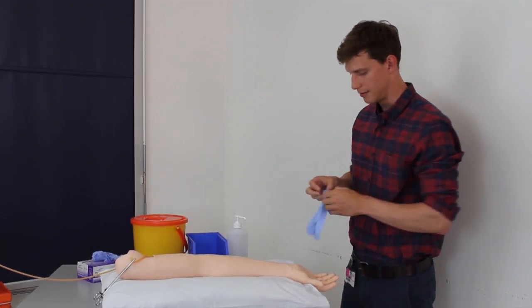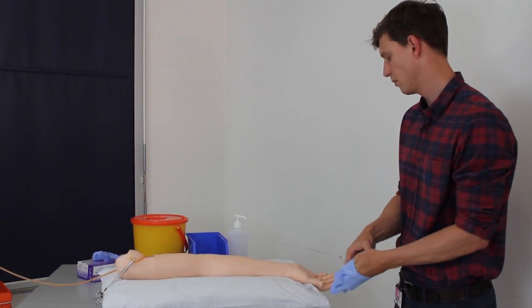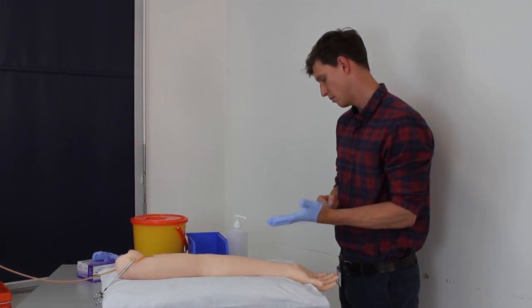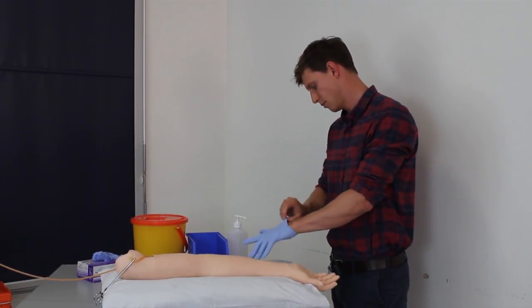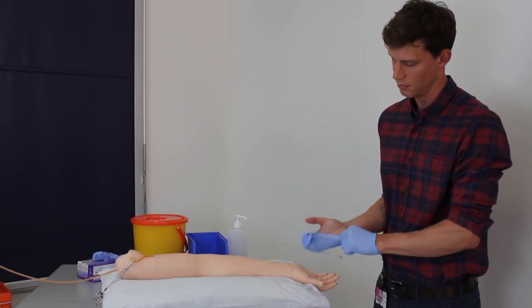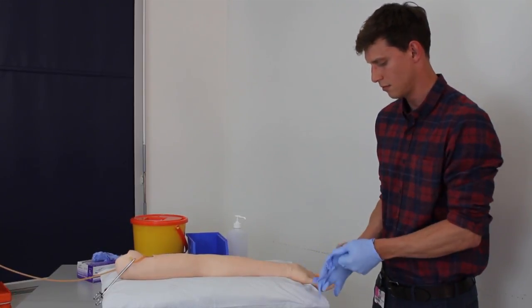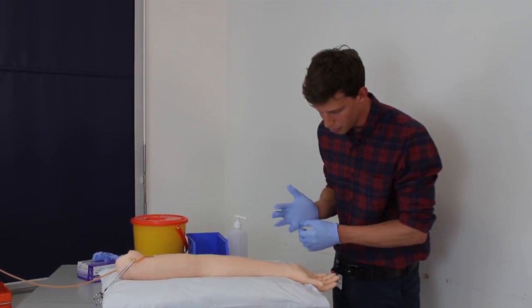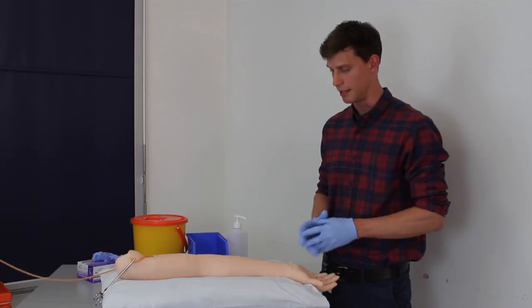I've washed my hands and I'm going to place my gloves on. Once my gloves are on I'm going to palpate both the ulna and radial pulse to see which one is more prominent and therefore better to take blood from.